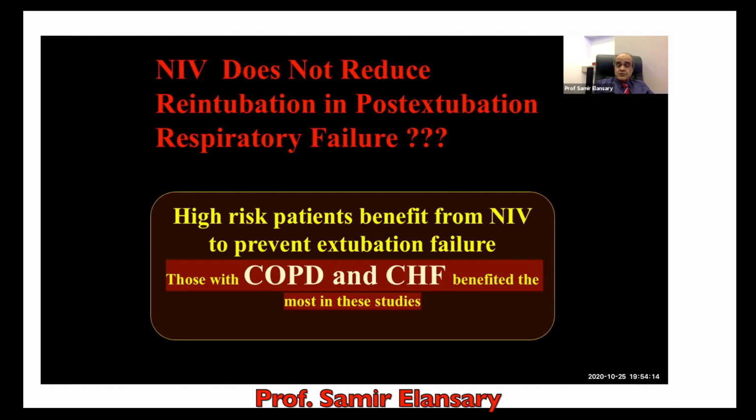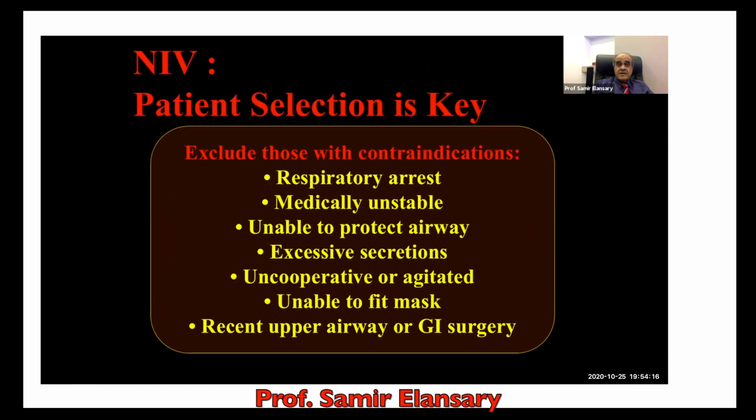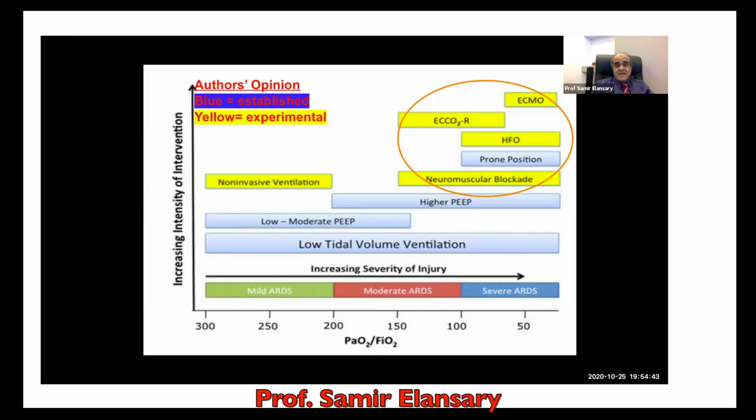Non-invasive ventilation in COPD and congestive heart failure. Don't use non-invasive ventilation in respiratory arrest, in a medically unstable patient, in a patient unable to protect the airway, in a patient with excessive secretions, in uncooperative or agitated patients unable to fit the mask, or after recent upper airway or gastrointestinal surgery. Try to avoid non-invasive ventilation.